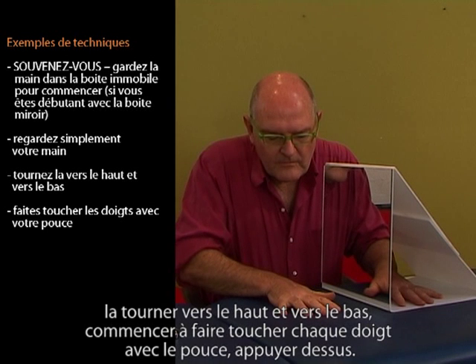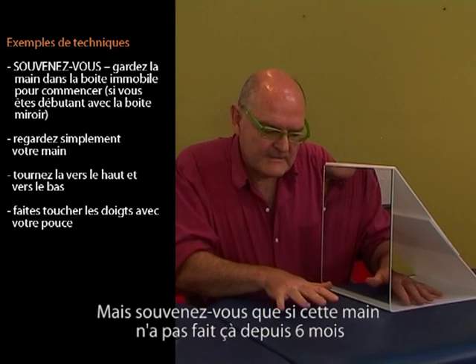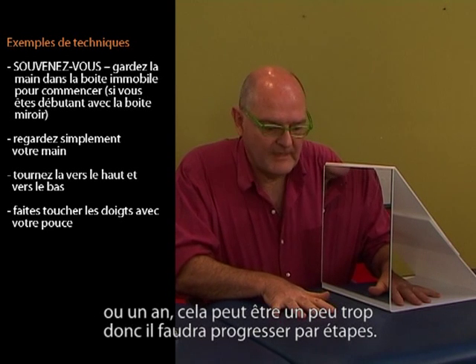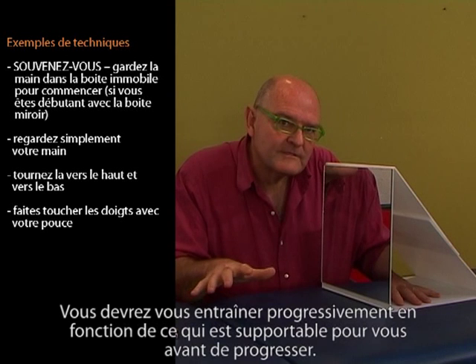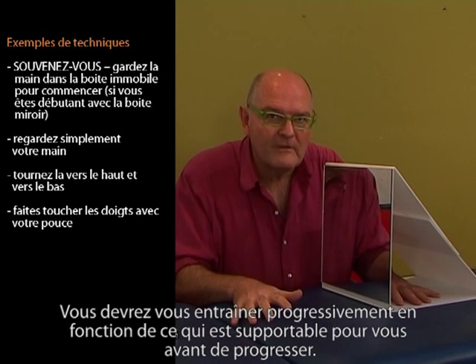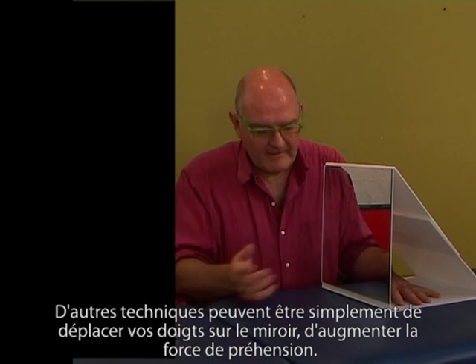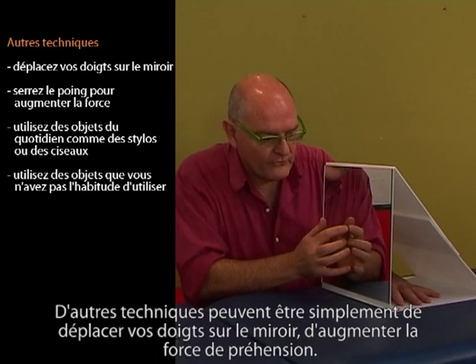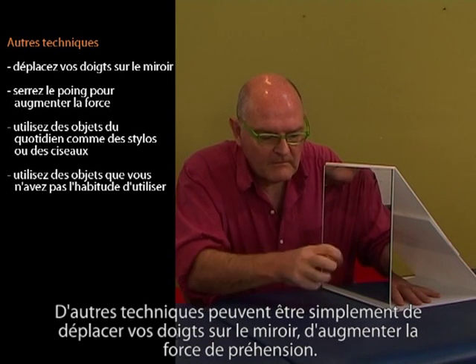taking weight on it. But just remember, if the problem hand hasn't done this for 6 months or a year, this could be a little bit too much. So you'll need to grade this. You'll need to work out a certain amount of activities that you can do that you feel comfortable with before you progress. Other techniques could be just crawling on the mirror, increasing the strength.